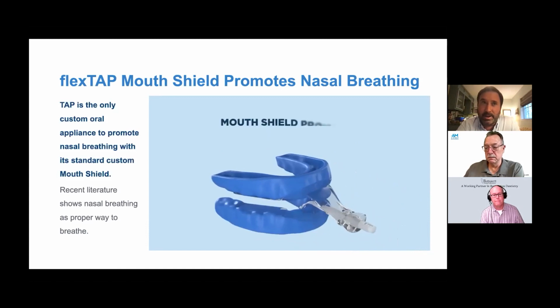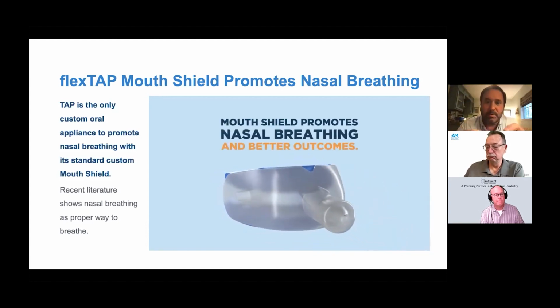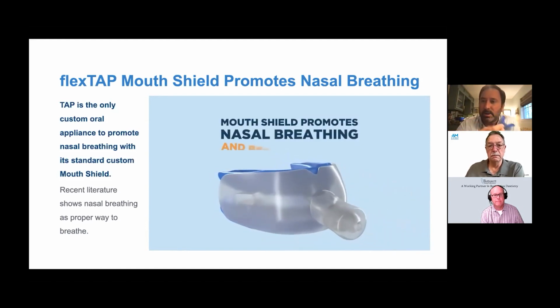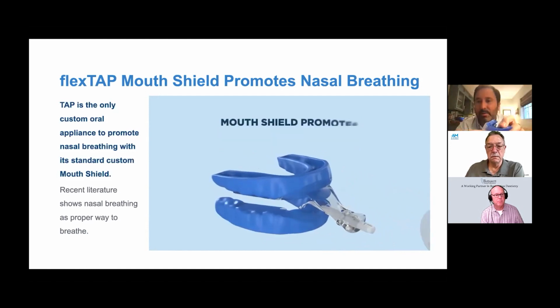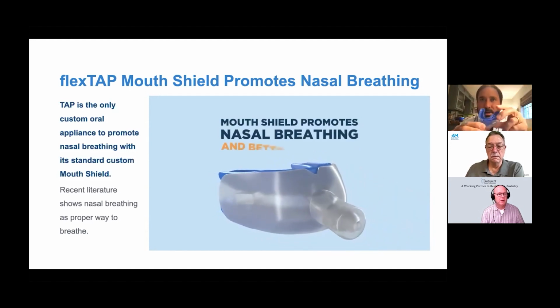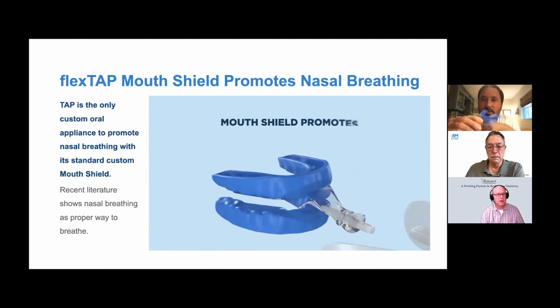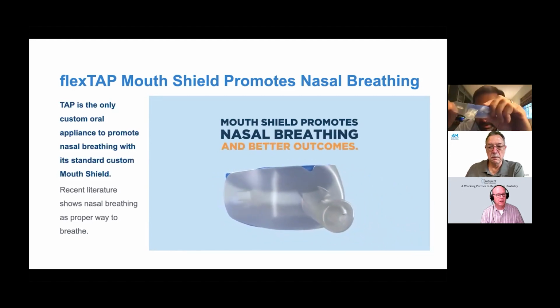Steve and I help. Again, I wear it, but for what I know, most people just slide it over the front and insert the device as one. Yeah. That's another benefit of this post design as opposed to some of the other taps that had mouth shields, where the post acts as a handle. So you just put it on and then tuck the flanges behind the lips.